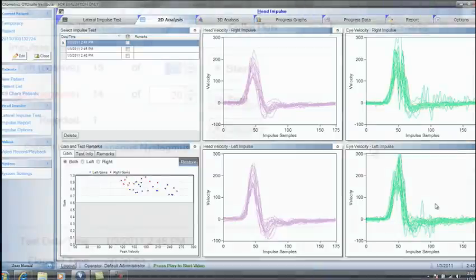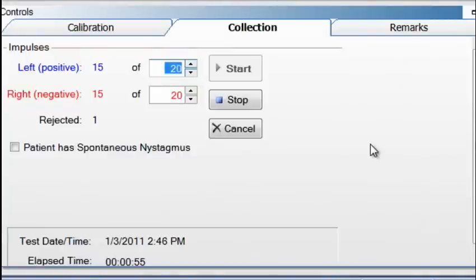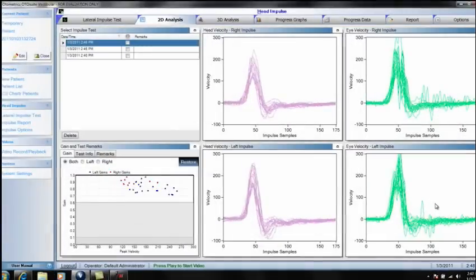We want to make one more comment regarding data collection. The analysis algorithm evaluates the good head impulses and ensures that the patient was performing the task appropriately. For example, if the tester performs a good head impulse, then the data is saved. But if the patient happened to blink or is looking around during the good head impulse, the analysis algorithm then discards the data as not being valid.